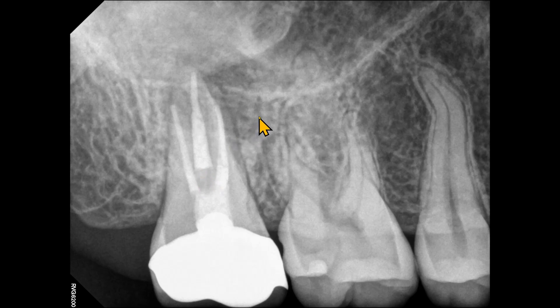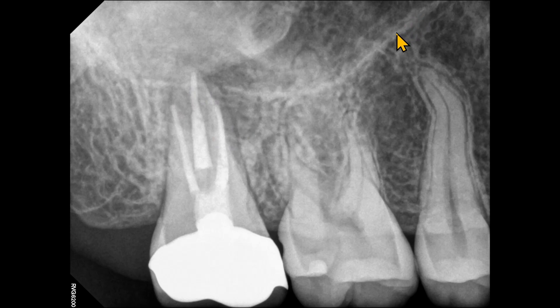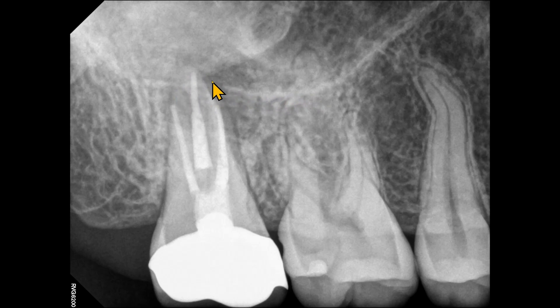We see an oval irregular radiolucency superimposed over the roots of the second molar. If you trace the floor of the maxillary sinus, it becomes thin or perforated in the area of the second molar. This is the inferior border of the zygomatic arch.